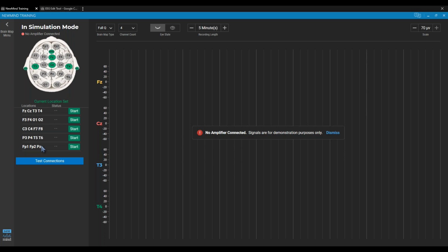So the 4-channel, it's going to take longer. It's just how it is. But if you add some extra time in, potentially with a 3-minute recording, you might be able to pull 30 seconds of data out of that. It's just hard to say.